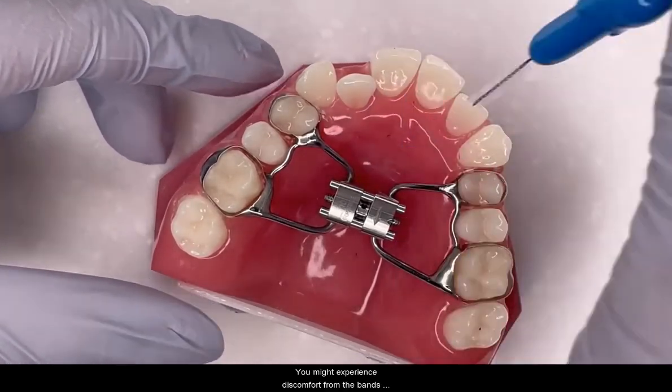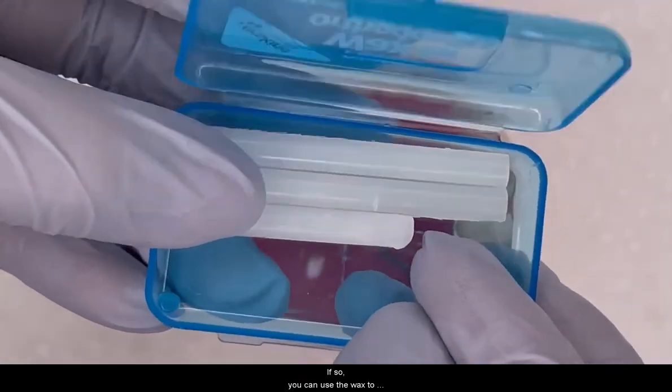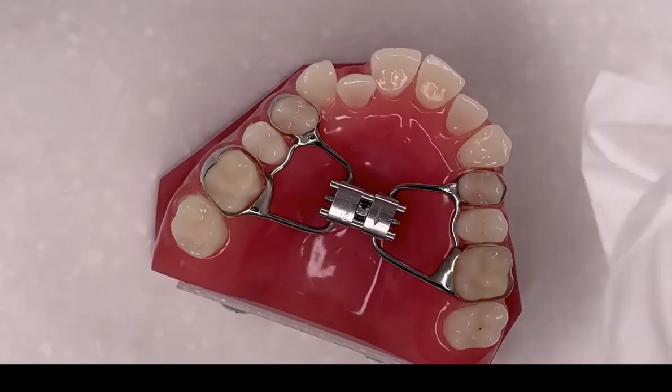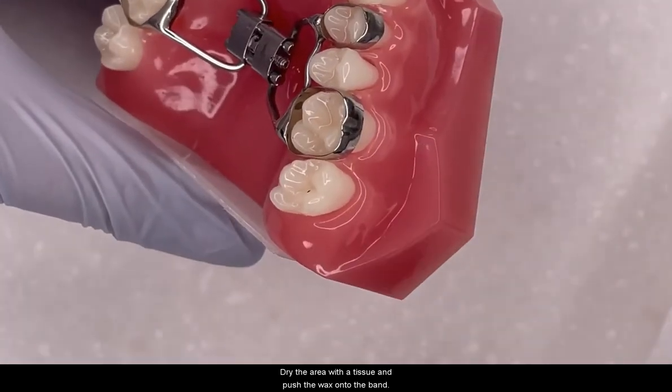You might experience discomfort from the bands rolling on your cheeks. If so, you can use the wax to provide relief by breaking off a pea-sized amount and rolling it between your fingers until it's soft. Dry the area with a tissue and push the wax onto the band.